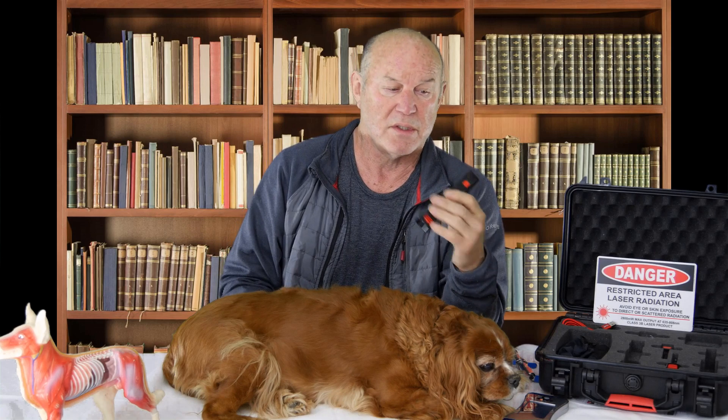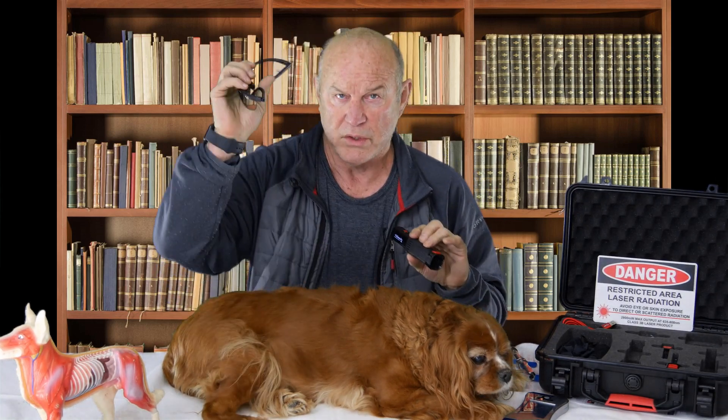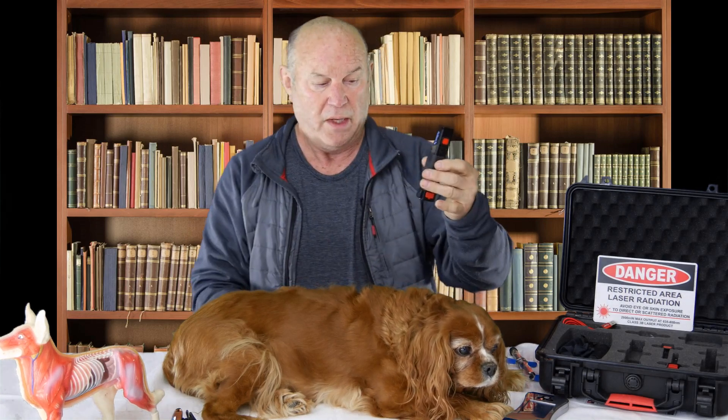You can go to A, B, C, D, etc., go to the Ds, go to disc disease, and pick out disc disease canine. There are 900 protocols for animals and 900 for humans in this device. Then you hit the button again. It'll remind you to put your glasses on. It's a class 3B laser, so glasses come in the case, though we don't use them. Then we hit the button and it's lasering.